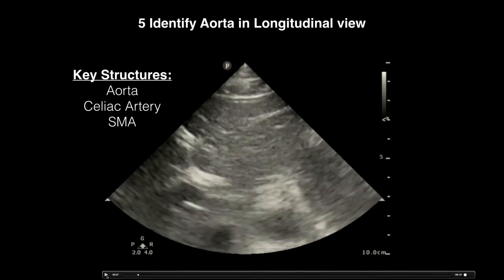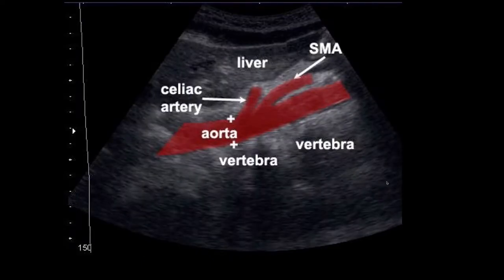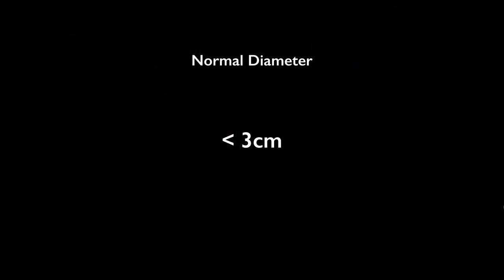When measuring, make sure you measure the abdominal aorta from outer wall to outer wall to include any thrombus or anything else that can enlarge the aorta. The normal diameter is less than three centimeters, and the emergency situation is when it gets above 5.5 centimeters. Everything between three and 5.5 centimeters depends on the patient's symptoms, vital signs, and how fast the AAA is enlarging.